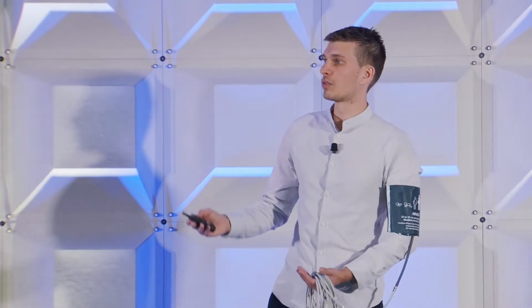So we started to take each component, each chip, and Google the identification of this chip. For example, this was the flash chip. We just took the identification number on it, Googled it up, and we found the vendor's selling point of this chip. Now we knew that this is the flash, and we wanted to extract the firmware from this flash.